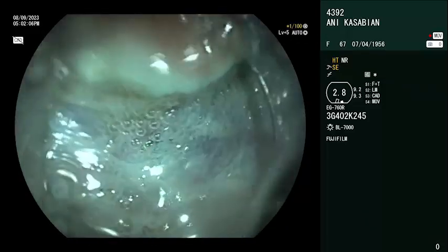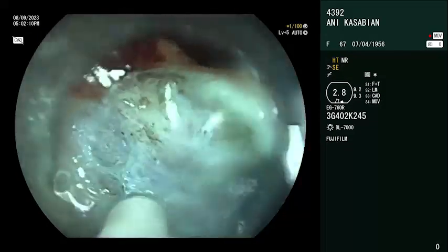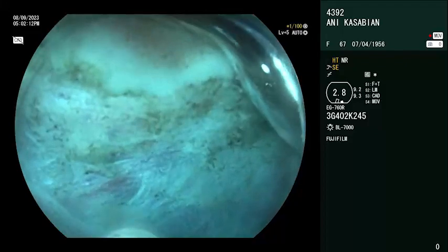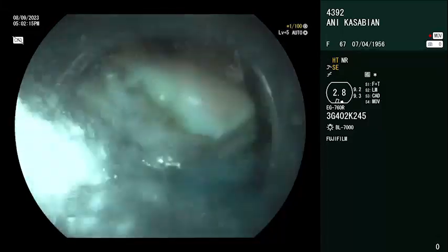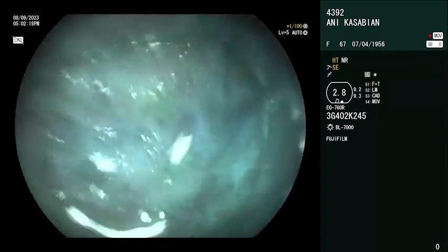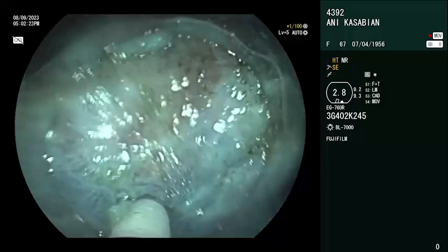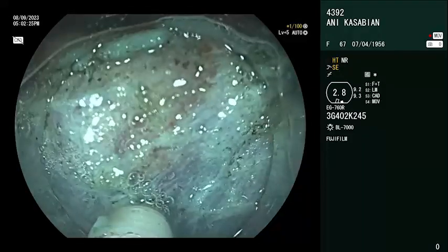After that, I inject more in, please. Okay. Out. Okay, we can see very well this vessel. Out. Thank you.